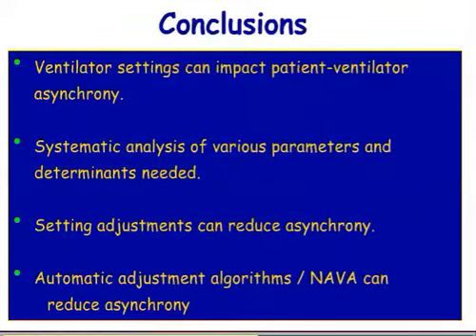To conclude now, ventilator settings, I think, can clearly impact patient ventilator asynchrony. A systematic analysis of the various parameters and determinants is needed because we're still not quite sure which asynchronies are bad for patients in terms of outcome and which are just there, as we discussed this morning with Laurent after the talk on NIV.